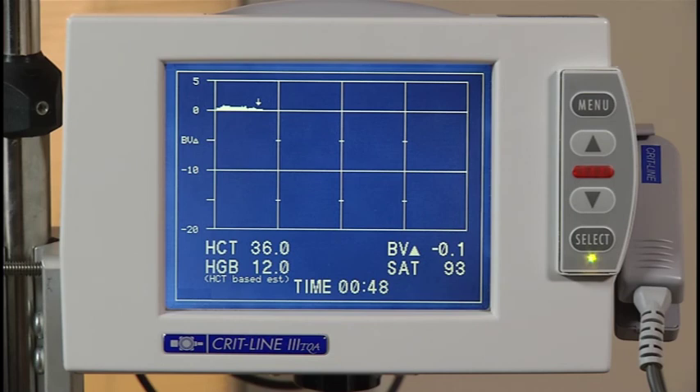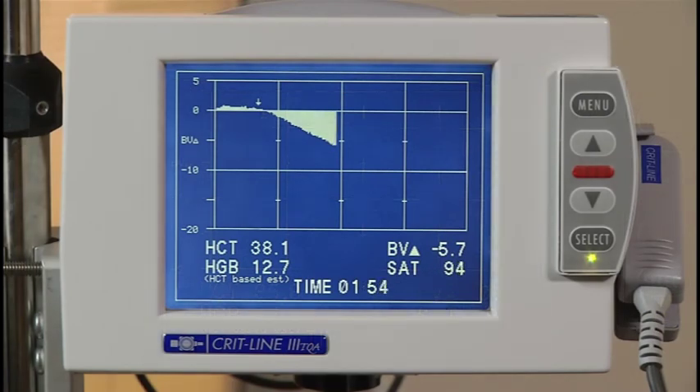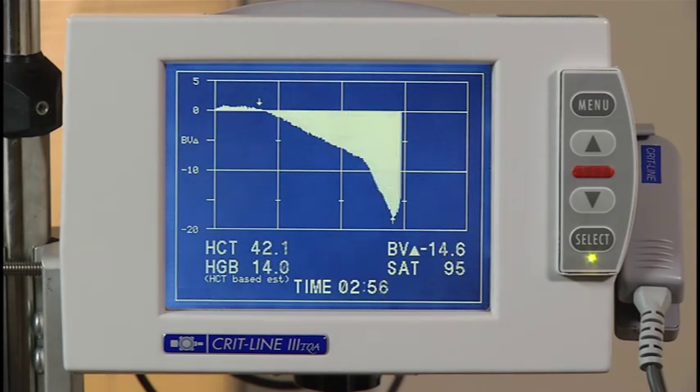In this example, the profile begins to decrease gradually starting at one hour. A gradual slope has been targeted to find the best compromise between a high ultrafiltration rate and the prevention of intradialytic symptoms — this is considered a Profile B. The ideal slope is not a fixed percentage of blood volume decrease and will vary from patient to patient. In the example, the operator has marked an intervention at 45 minutes into the treatment. To mark an intervention, press the up or down arrow anytime during the treatment; the marker can be used to remind you that an intervention was done at that time. At two and a half hours, the blood volume profile begins to get quite steep — this is considered a steep slope or Profile C. A steep slope bears a higher risk of intradialytic symptoms.